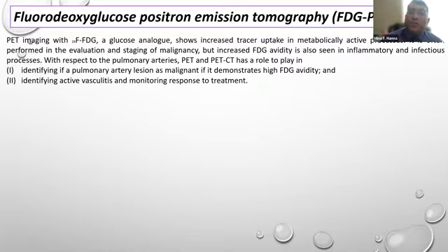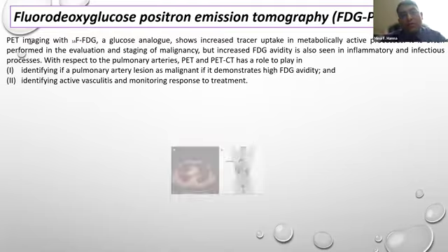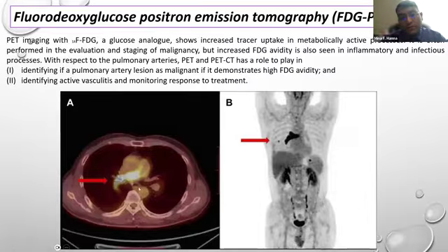Or in a patient with metastatic disease, you want to see if the metastatic lesion is reaching the heart, the vessels, or the lung. You can know exactly how it is going. The other etiology is vasculitis, to show the inflammation as a metabolically active vessel wall, but you can see vasculitis with MRI and CT too, if there is an enhancing vascular wall. But it's a way, at least. But I think it is very important if you are talking about a tumor.